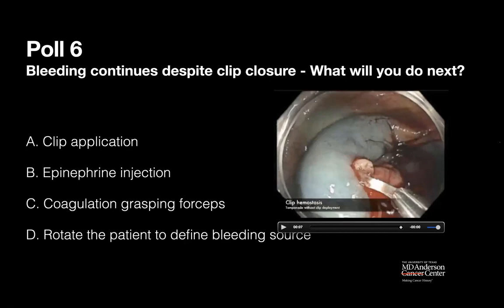As part of my visit with the patient in the clinic, I shared with the patient that I will sedate them lightly and explained that I would need them to hold their breath at different points in the procedure to allow me to do a better injection, or if there were bleeding, if you hold your breath, the abdomen will be still and the colon will not be moving, and it would allow me to find the bleeding source and treat it easily.